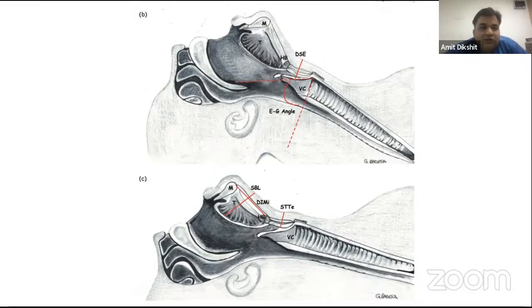And I think what ultrasound has done is we have started anticipating the airway in a better fashion, and therefore calling for help, getting all gadgets in place, and making a backup plan. It has reduced the anxiety for us, because most of the time there is a lot of adrenaline when it is a difficult airway. So till this stage, I think ultrasound has made some dent in reducing the anxiety, and the anticipation skill set is improved.